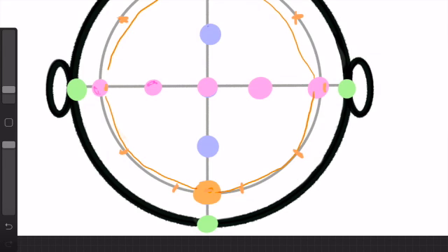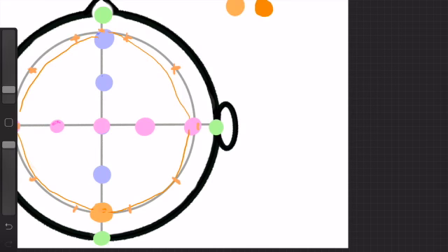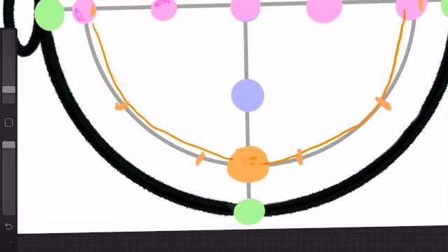Divide that by 2 and we get 31.5. So now we're going to find points O1 and O2. We need the total circumference, divide by 10, and then divide by 2. So the total circumference is 63.5 divided by 10, which would be 6.3, but I'm just going to round that to 6, divided by 2 is 3.